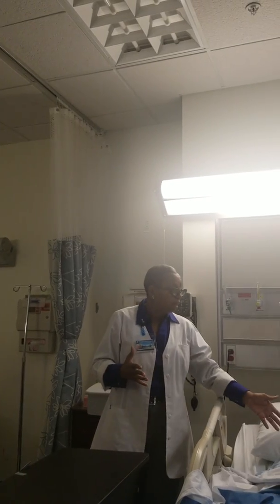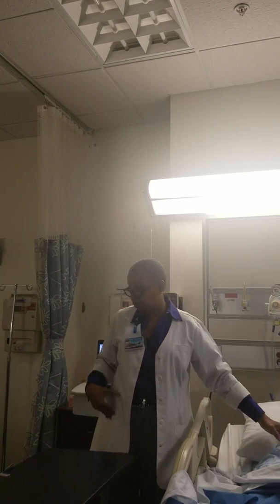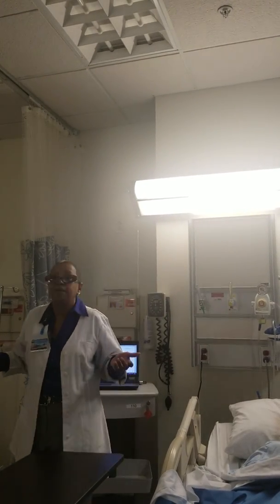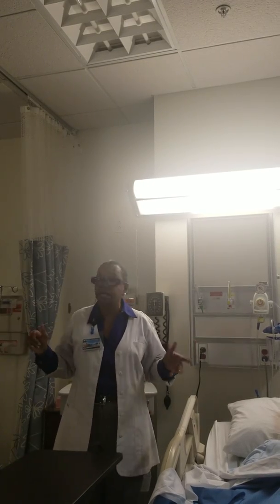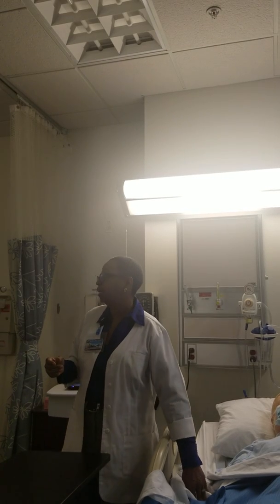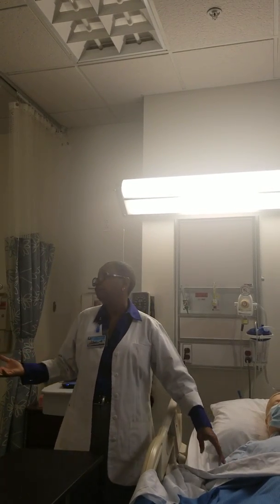In terms of how long something can stay, when you have either that groin line or this single lumen, like I said, they call it triple lumen, those can usually only stay about 5-7 days. They've got to go. They're short term. If you have a PICC, that can stay with you. That's long term. They go home with a PICC. They tell you, I had my PICC for 6-7 months.